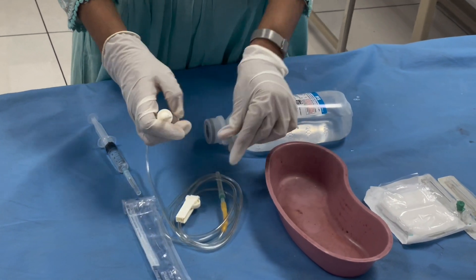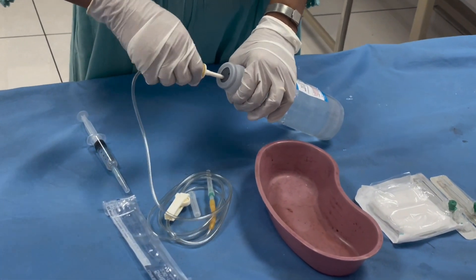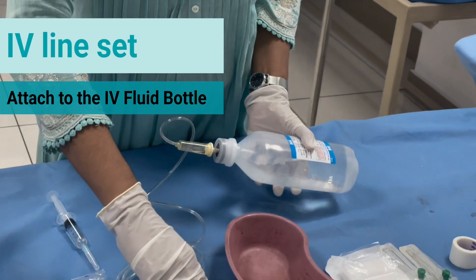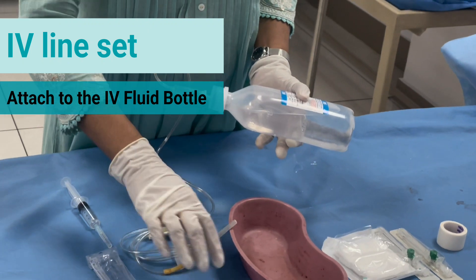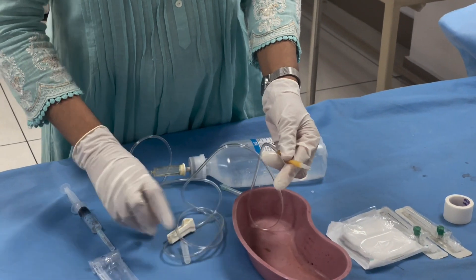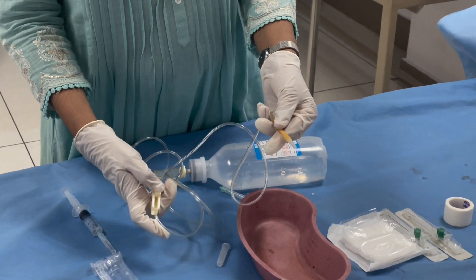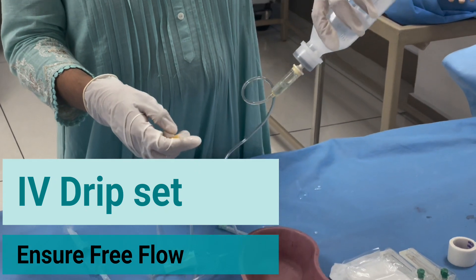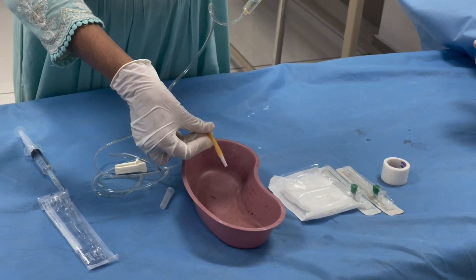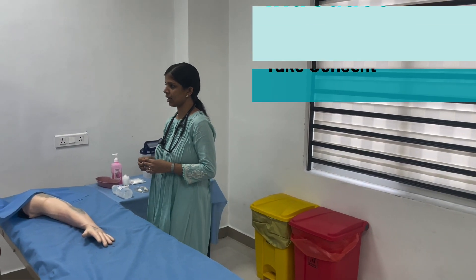Attach the IV drip set to the IV saline bottle. Open the IV drip set and ensure a free flow of the IV fluids. Close the set and keep it ready.